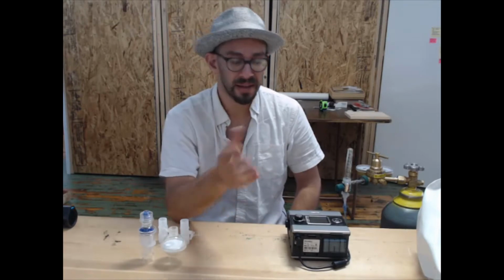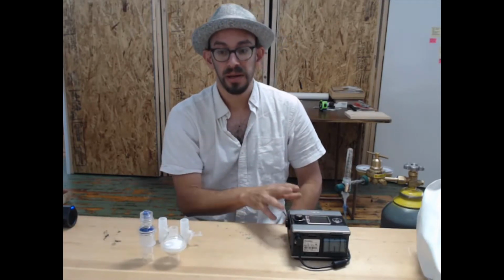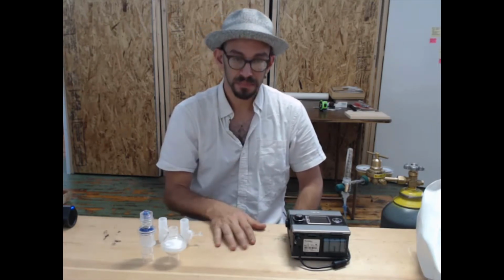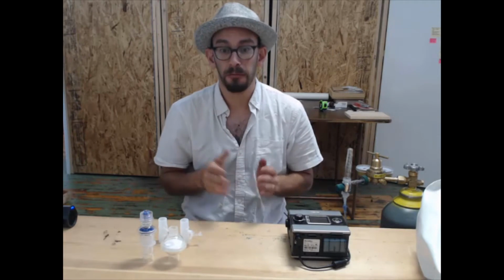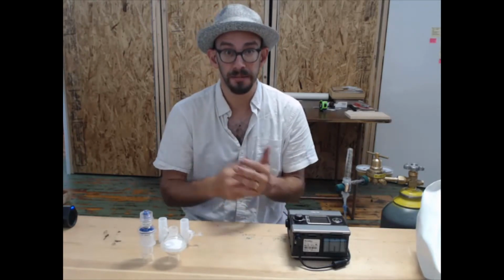In this video today, I'm demoing with a ResMed S9 CPAP. If your model of CPAP is different than this, that's fine. Every CPAP we ship works in the same operating range and has been tested to work with this patient circuit.